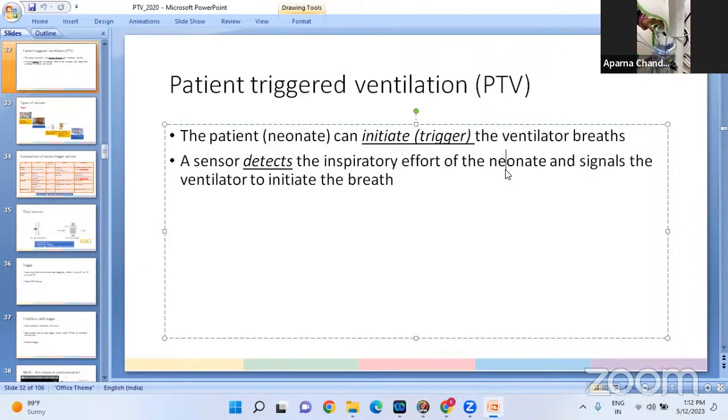So this is the proximal heater wire sensor, and this gives feedback through these 2 heater wire adapters. So you have the yellow adapter here. Each of these come with their own slots, and this is the blue color heater wire adapter. Right? So these are the 2 heater wire adapters.